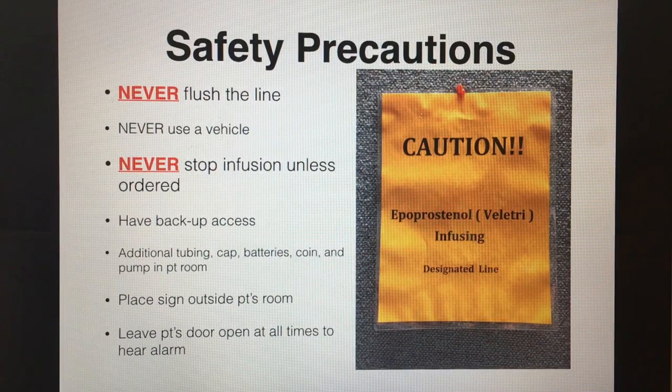This is very, very important. So you never, ever flush the line with any of these medications. Even if you're switching sites, you do not, once you disconnect, flush the line. Again, that entire prime volume that we determined earlier is sitting in the line. So if you flush that line, you'll be bolusing the patient with that medication volume. So never, ever, ever, regardless of any reason, flush the line.